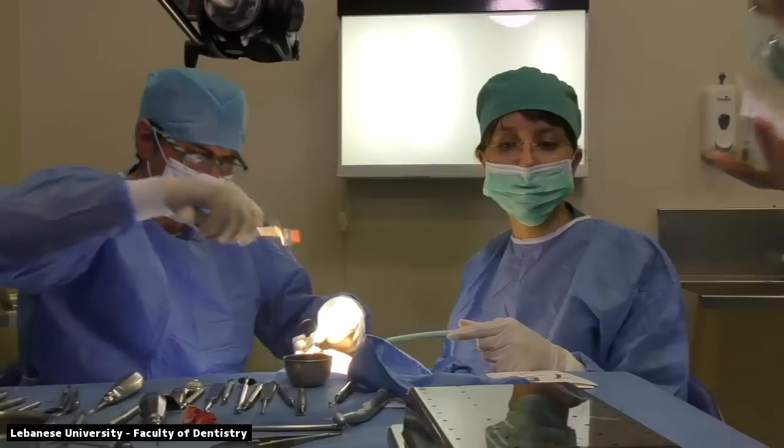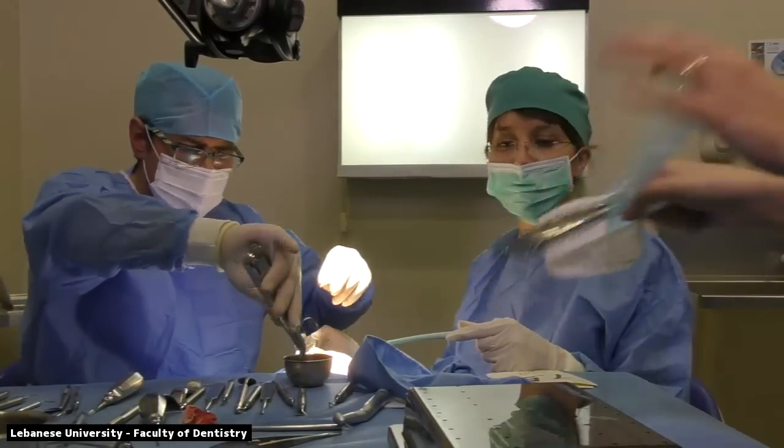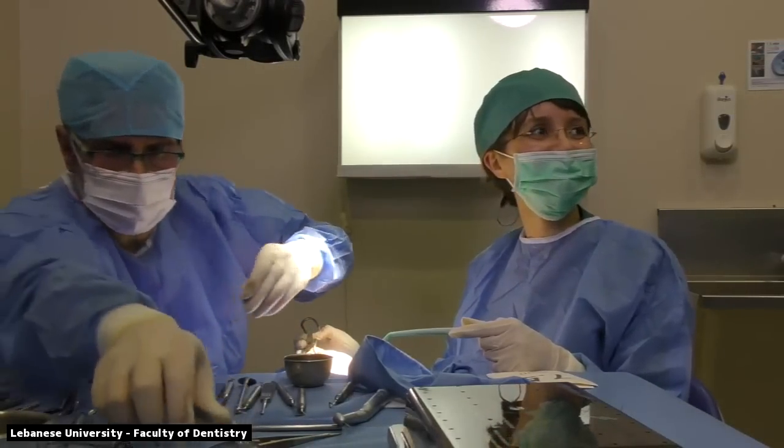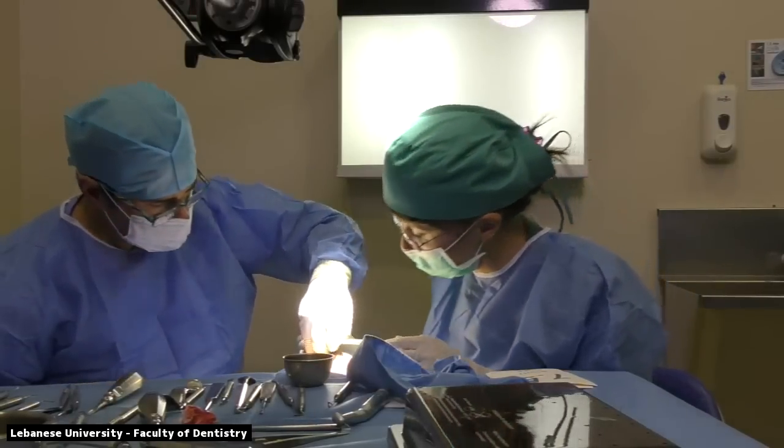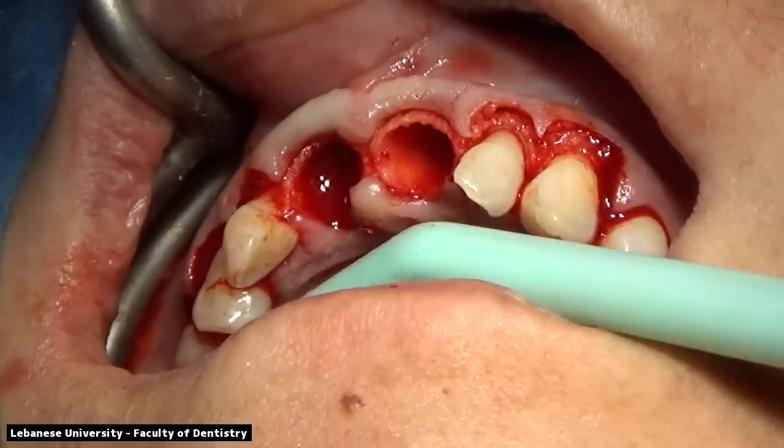So we're doing a rotation, like a circular movement, to remove it as atraumatically as possible without the buccolingual rotation of the root. You can see that the other remaining root has been removed as well. We will examine both sockets right now.